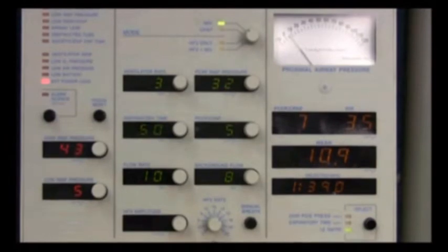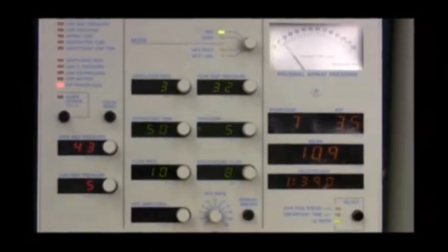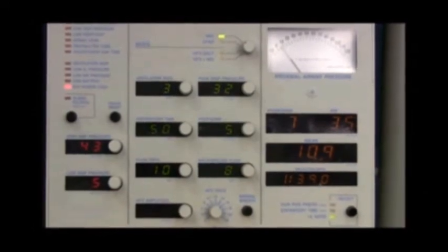As the patient improves, he will eventually need to be weaned from the LifePulse. The goal in many cases will be to wean the patient back to conventional ventilation at much less support than the patient was on before beginning high-frequency ventilation. However, ideally, the patient can be weaned directly from the LifePulse to nasal CPAP. There are a few guidelines for weaning.